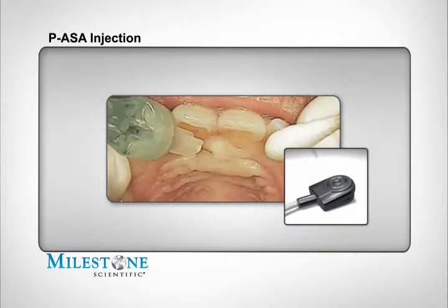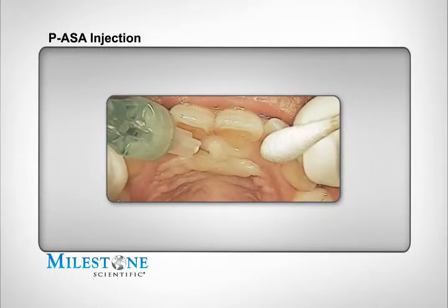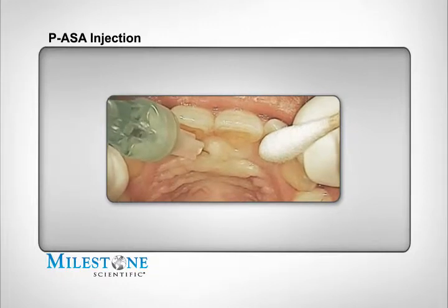If aspiration is negative, maintain position and deliver the proper amount of anesthetic. Do not exceed 3/4 of the needle length penetration into the canal. As the anesthetic solution is delivered, you will notice distinct blanching of the tissue.